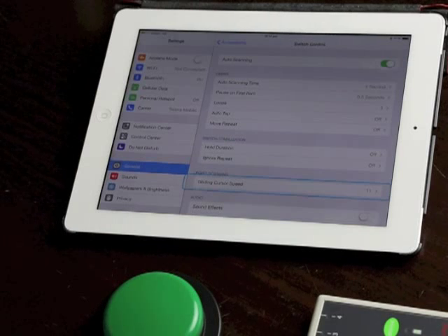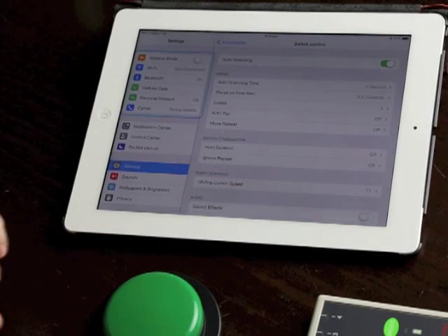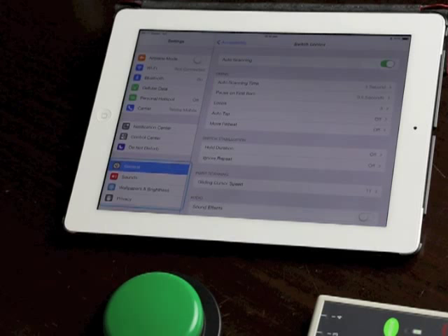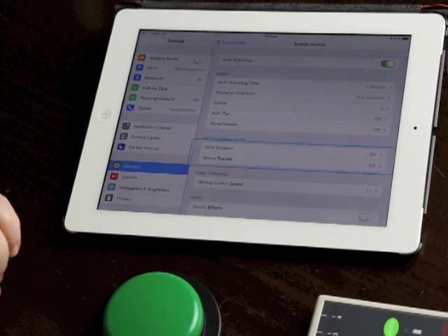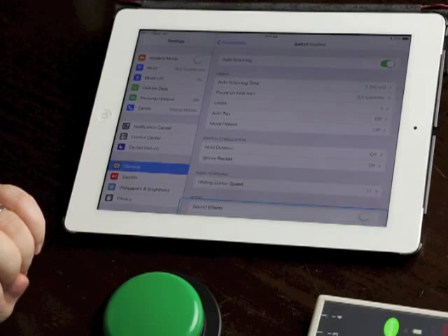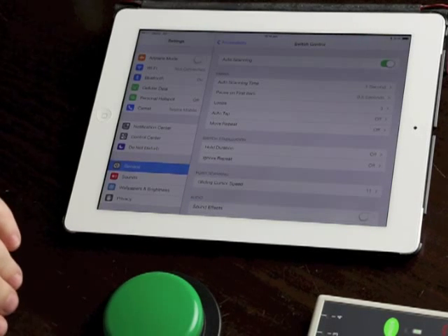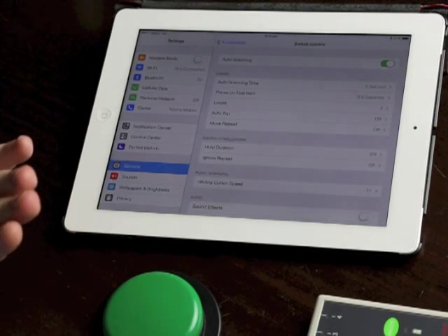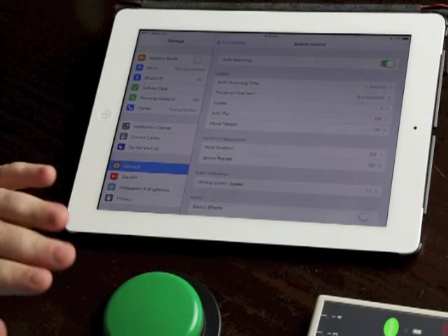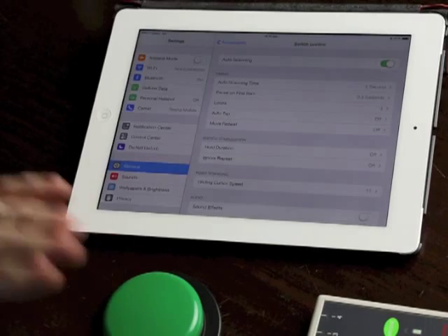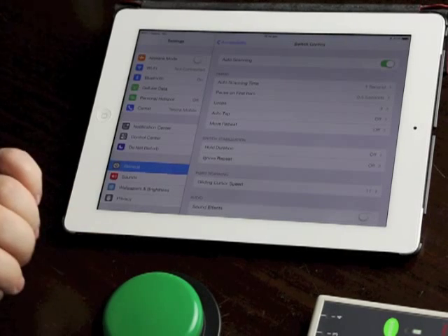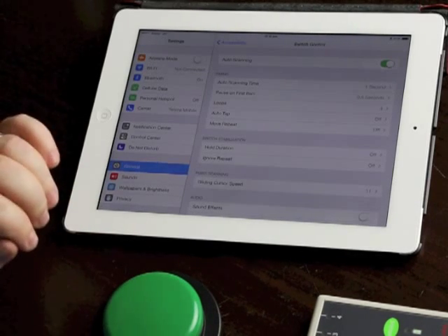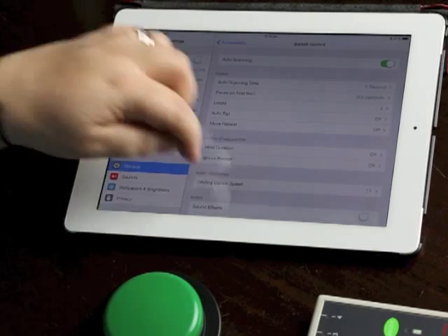Hold duration is the period of time the user needs to press the switch for before the iPad reacts to it. So this is really useful for someone who accidentally does lots of quick hits of their switch. You can set it so that it needs to be a much more deliberate press. Ignore repeat is also useful for someone who does accidental second presses. So they press the switch once, they mean to do that and then they accidentally hit it again. You can set it to ignore that second press.